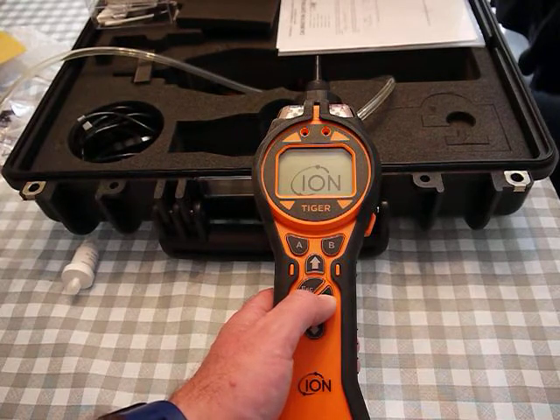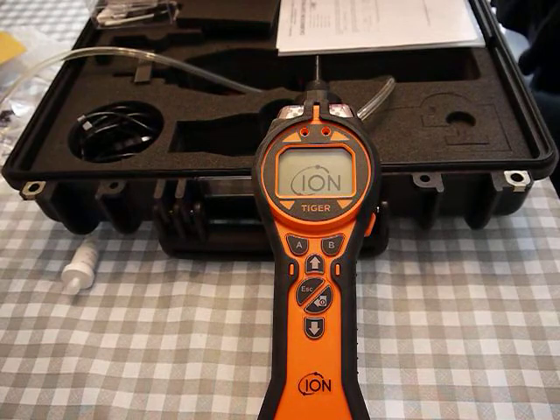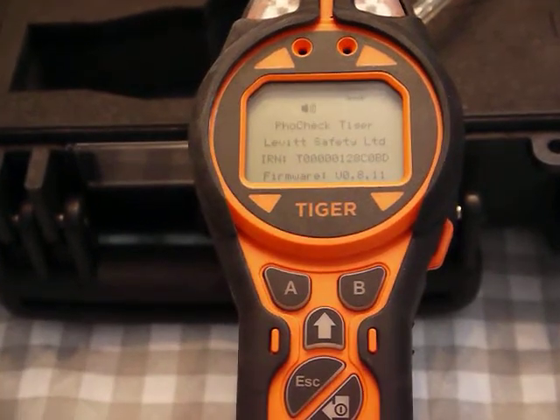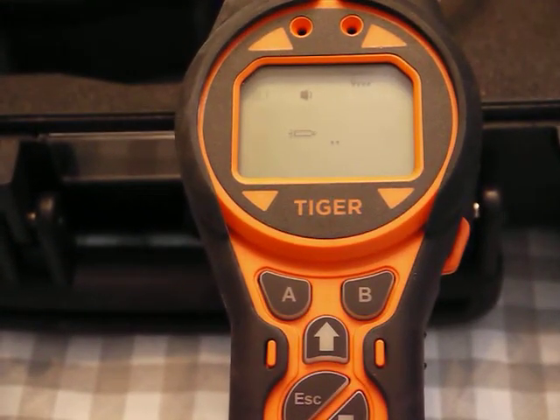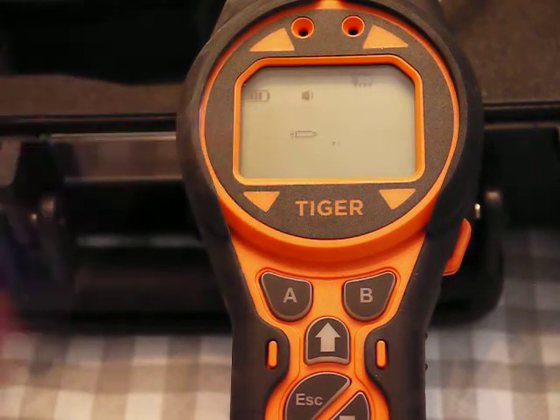I push the button and you'll see the display light up. The display is going to go through some self-checks — it's firing the lamp and shows a little lamp icon on there.